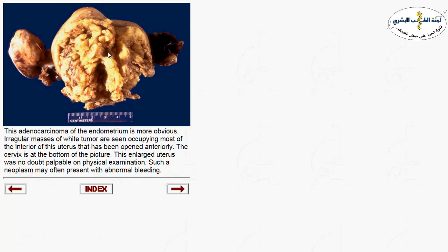Here you can see an ill-defined mass filling the endometrial cavity with areas of necrosis — the yellowish discoloration mostly representing necrotic tissue. This mass filling the whole endometrium most likely represents malignancy.